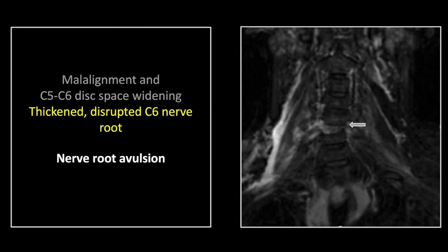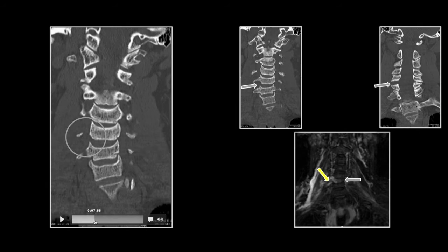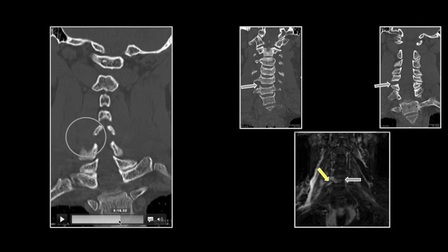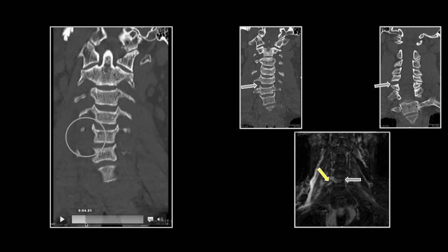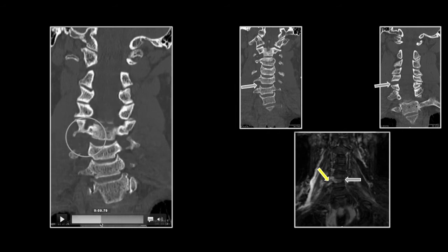We are fortunate enough here, even with the relatively low resolution, to see the thickened and disrupted C6 nerve root, which is the dread complication of this particular injury. This type of injury usually results in a fairly long-term brachial plexus palsy. There is the widening of the intervertebral disc space, as well as the facets and lamina on that side.